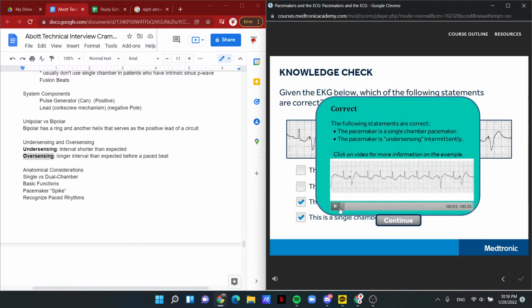This is a very obvious example of undersensing, with pacemaker spikes occurring right after an intrinsic QRS complex, and in fact this spike lands on top of the T wave. If we again use a pair of calipers and set it for this interval between spikes, we can see that this interval is the same. If we measure back from the spike, it appears that the pacemaker probably sensed this beat, but did not sense this one. However, there are no other spikes in here, and so it was inhibited by some of these beats. So what we have here is intermittent failure to sense, otherwise known as undersensing.